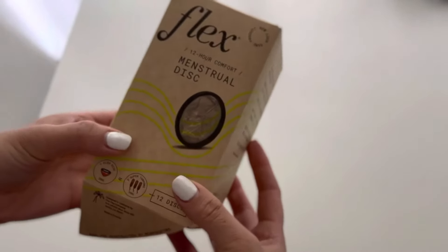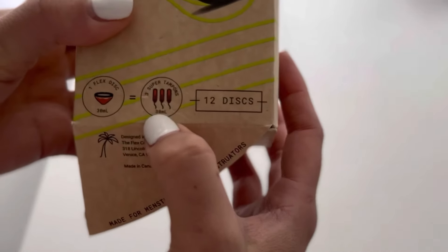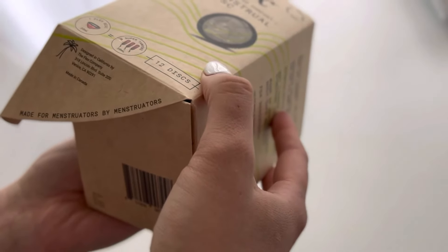Hey guys, welcome back to Life for Run. Today I'm going over a quick overview of the Flex Menstrual Disc. This is my first attempt at the disc — I tried it on earlier and just recorded this right now so you guys can see what the box looks like.